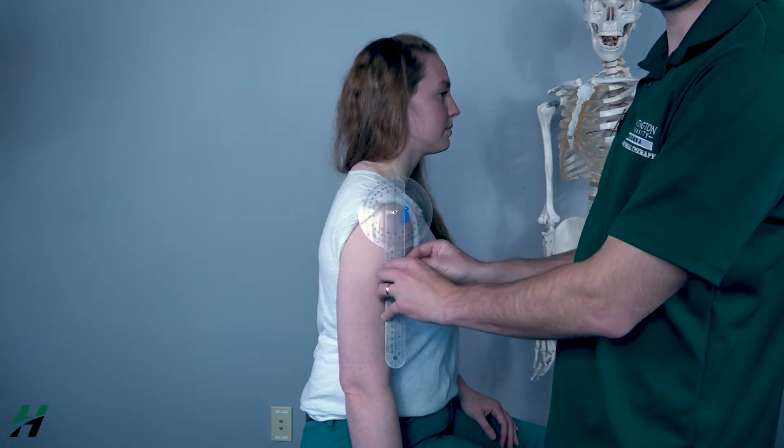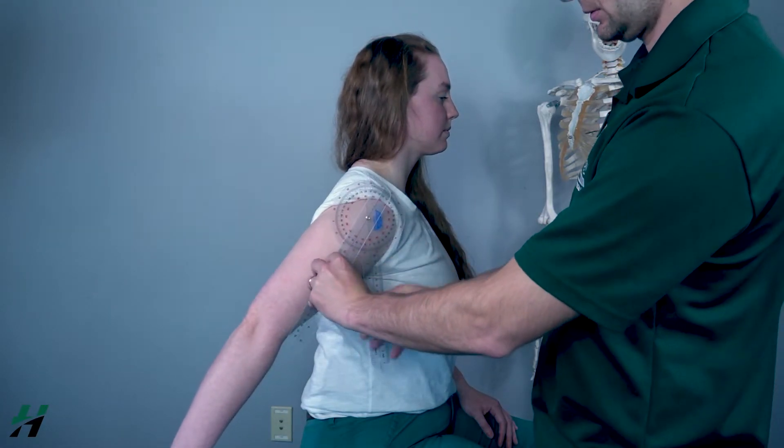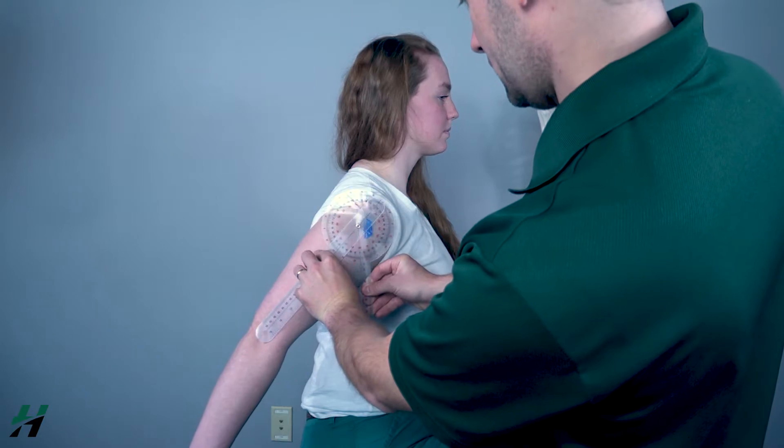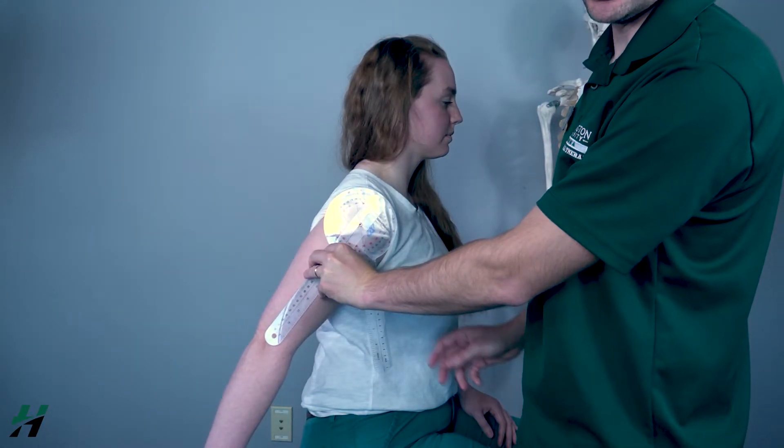Rachel, if you could bring your shoulder back as far as you can. Here we're looking at 48 degrees of extension.